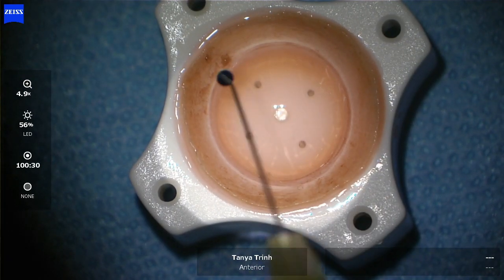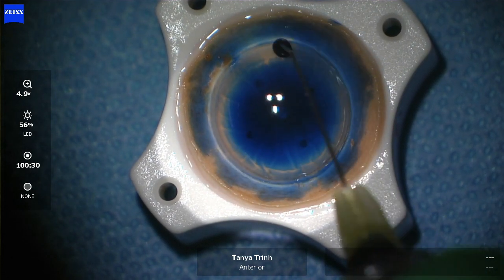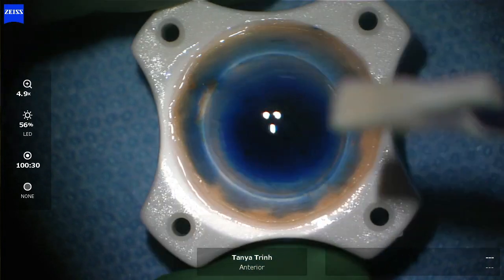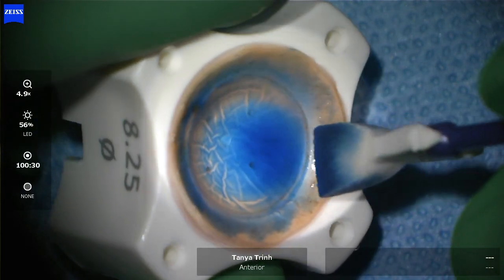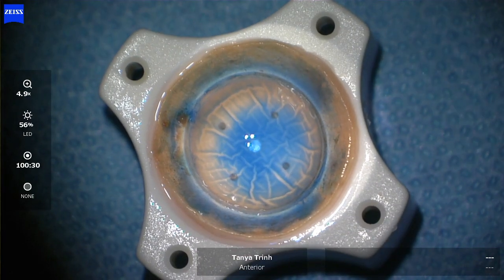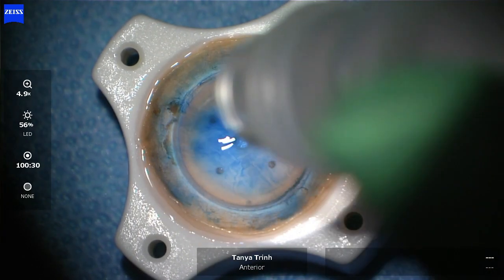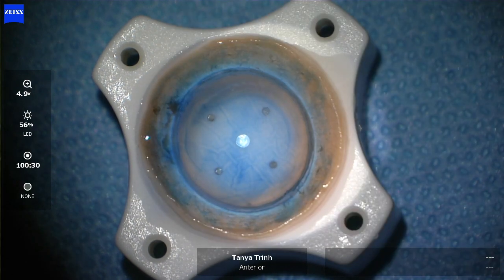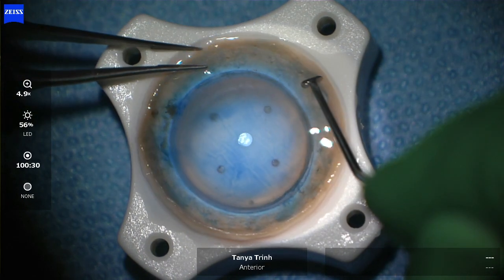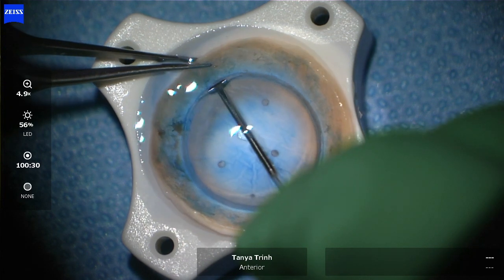Of pigment all throughout the view, which can make it a little bit annoying. I'm now assessing the quality of the tissue by adding Vision Blue — you only need a few drops and it only needs to be on there for a few seconds. I'm gently wicking off the excess fluid, and we're quite lucky here in that the tissue is quite good quality as given by our eye bank today. I'm gently placing some balanced salt solution onto the surface, always with a dripping manner.